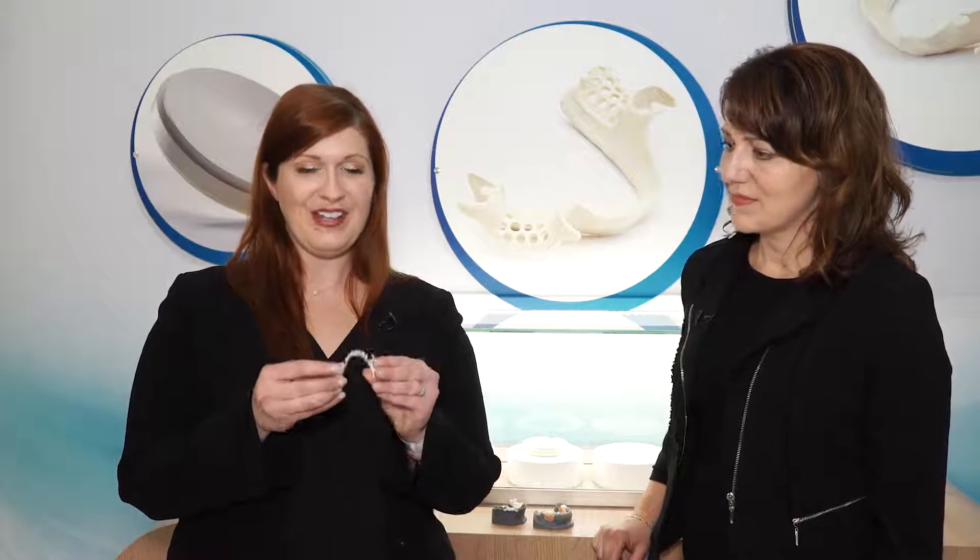Hi, I'm Dr. Pamela Miragliano-Muniz. I'm the editorial director for Pearls for Your Practice, part of the Product Navigator newsletter for DentistryIQ.com. I'm here in Cologne, Germany at IDS, and what an event this is. I'm here with Sean from Solvay Dental 360, and we're here to talk about these little tooth-colored removable partial denture frameworks.